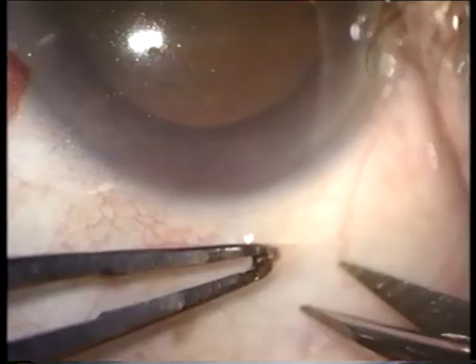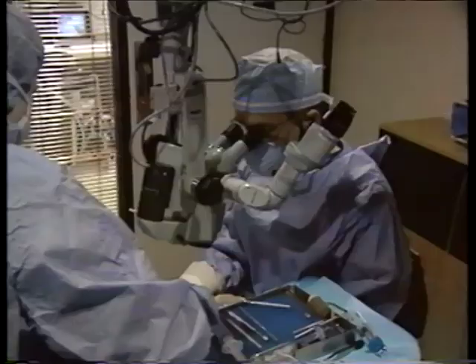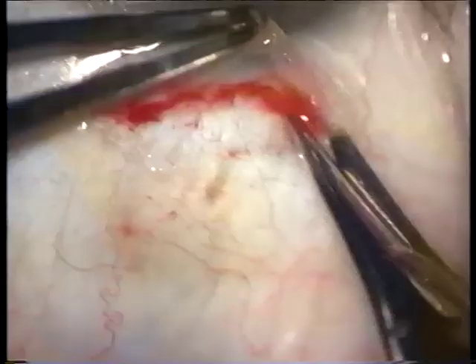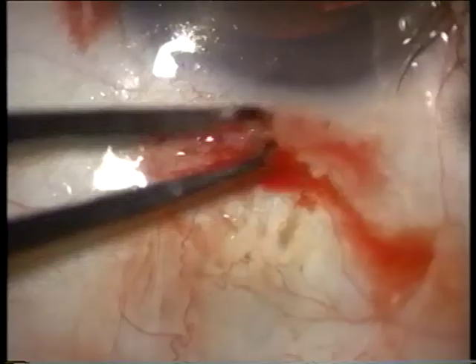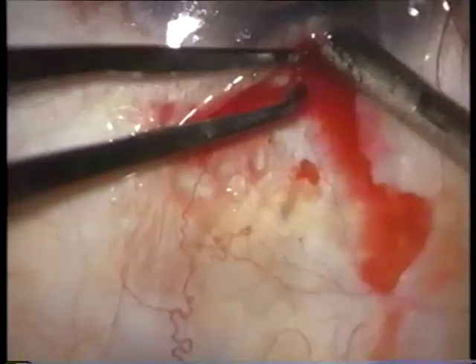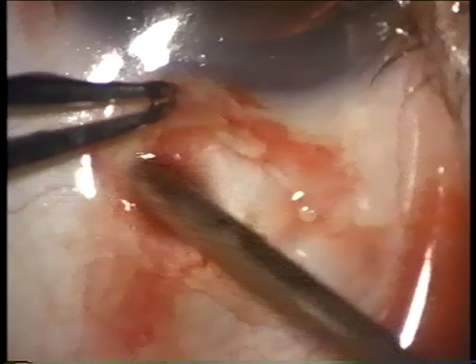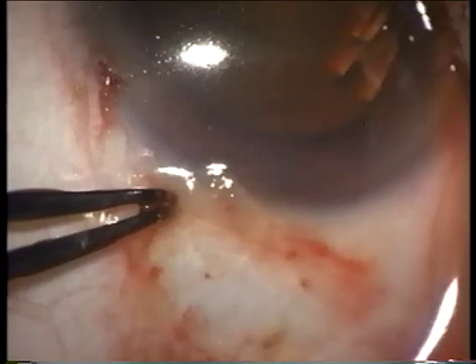Are you feeling anything? No, I'm feeling fine. We're using a small limbus flap here, this is going to be a 5.5. We're operating temporally because of against-the-rule astigmatism. I do often use a clear corneal incision with some foldable lenses and temporal incisions, but I don't hesitate to use the scleral tunnel approach temporally as well.